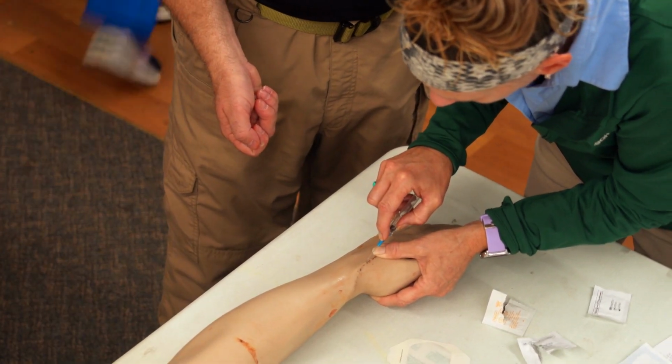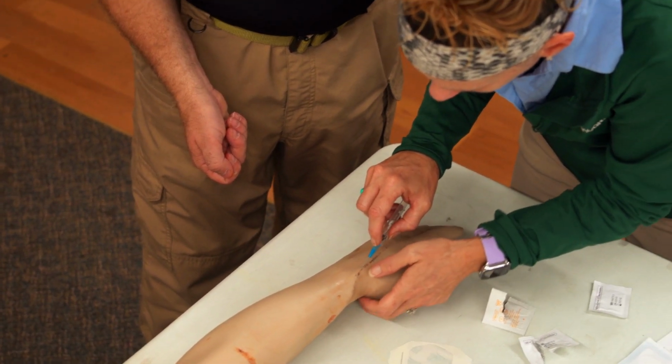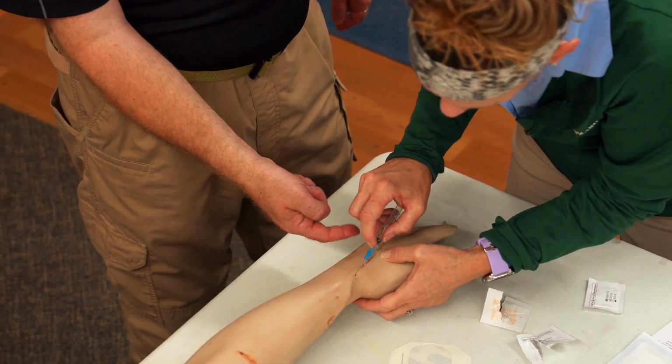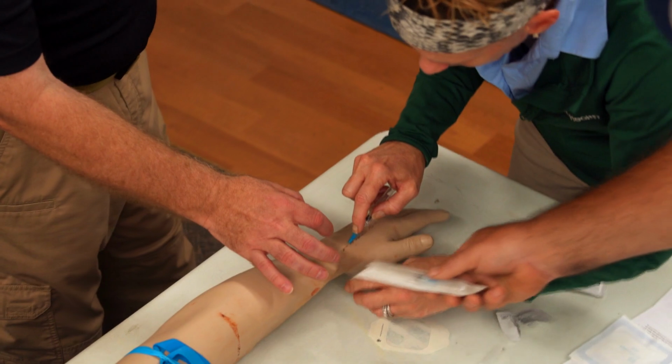Advancing the catheter. Then you advance the catheter and everything goes back. So go through, feel the pop. Okay, yep, there you go. Now go on the back side of the tab and push with this finger while holding these steady. Push that forward. There you go, there you go. Now take that thumb and put it over there.